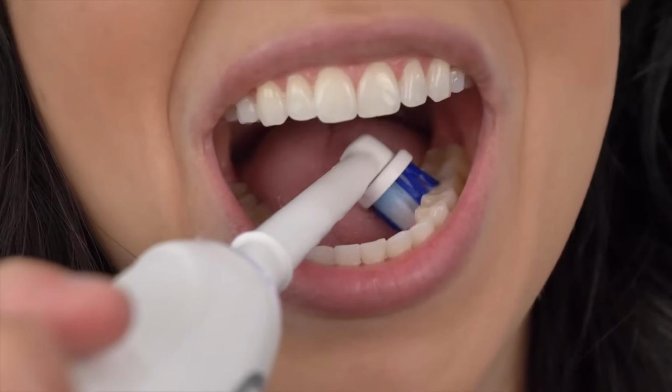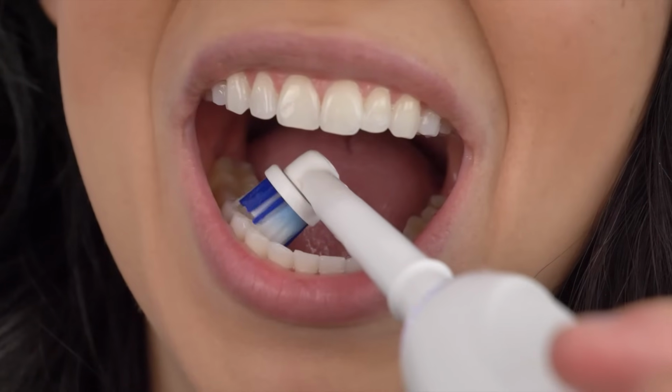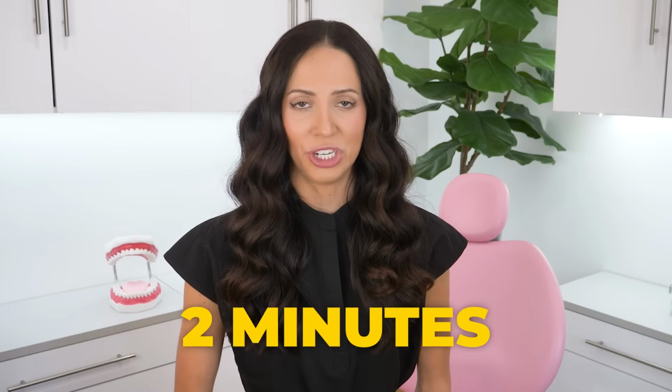Then after brushing all of the upper teeth, next I'll brush the lower teeth, 30 seconds on the lower left and 30 seconds on the lower right, totaling a full 2-minute brushing session.